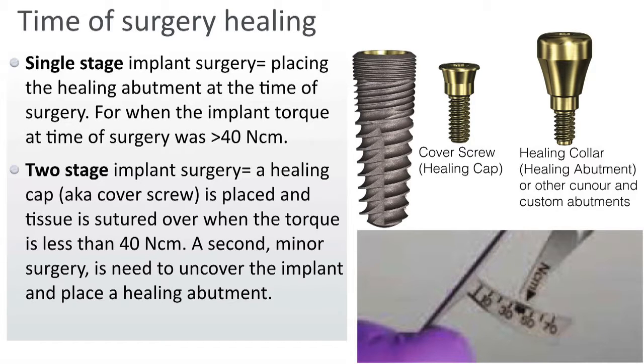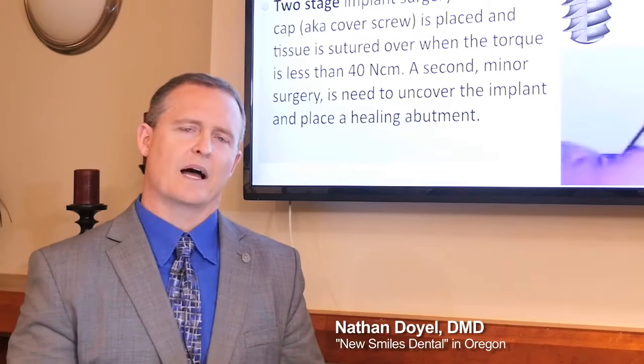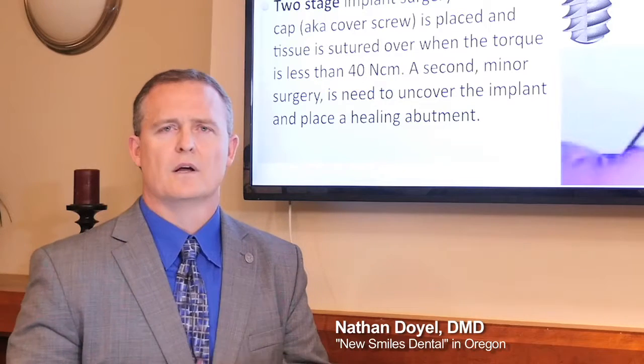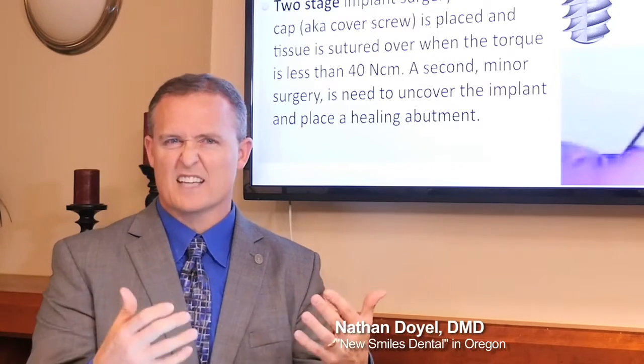Again, this is how I always place my implants with a torque wrench. I always want to know what the torque is at the time of surgery. Implant Direct carries one that's a predetermined torque wrench, so it's more of a restorative type. That's the kind I use when I'm restoring an implant. I want to set it at that torque level, and I want to have it exactly at that torque. In this case, when I'm placing the implant, I want to know what the torque ends up being, not predetermine it to be 35 or 40. I want a torque wrench that tells me at the end what I've gotten to. So if it torques down and finalizes at 70, I want to know that.